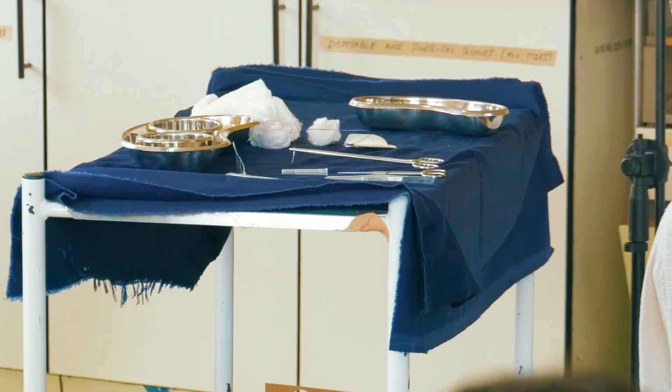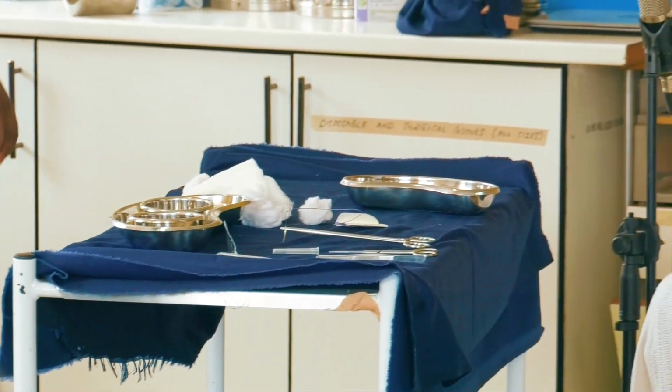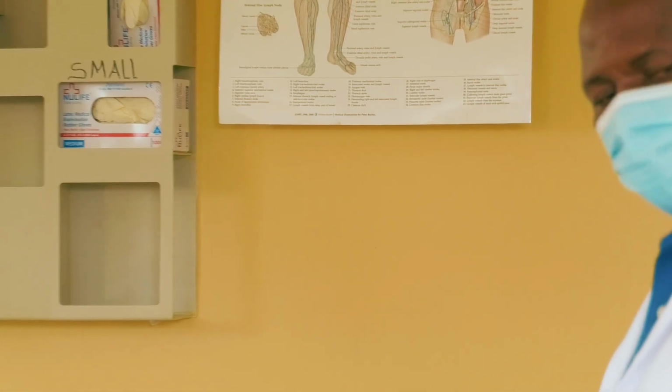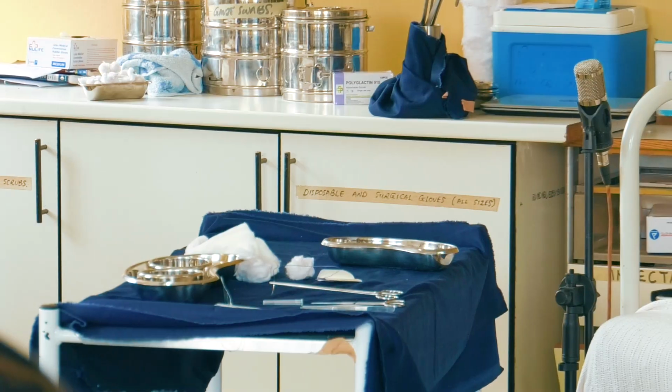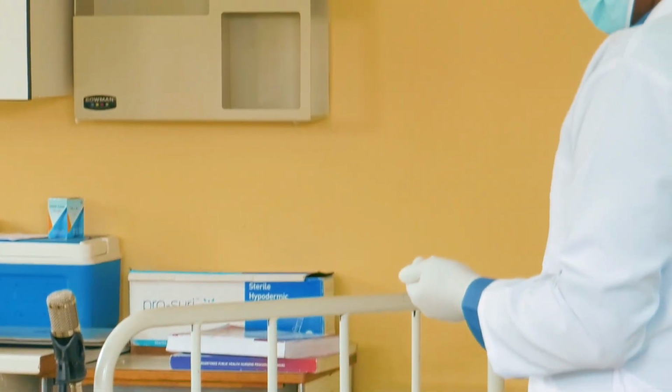Is it possible? Okay. So, I'm sure we all saw how we are supposed to do the local infiltration. You give it 2-3 minutes so that the drug can start working. You can even try with the needle, or you can touch the patient with the needle and ask the patient, are you able to feel any pain? Then if the area is numb, the drug is working well. The patient will tell you there is no pain.